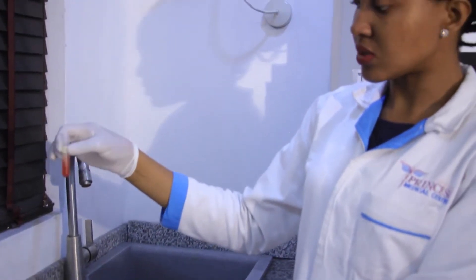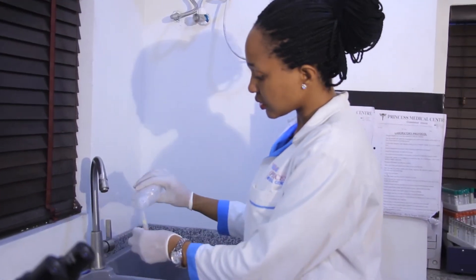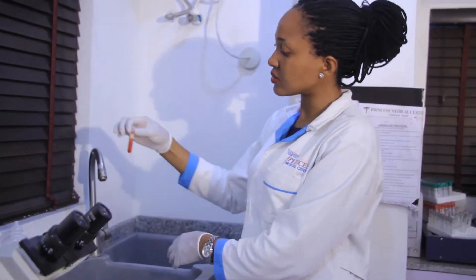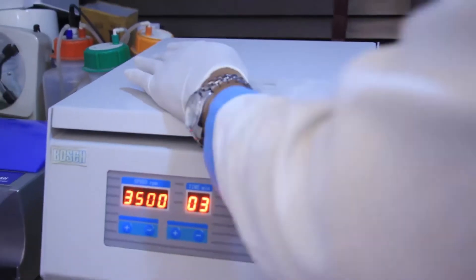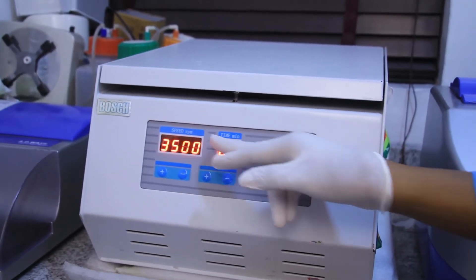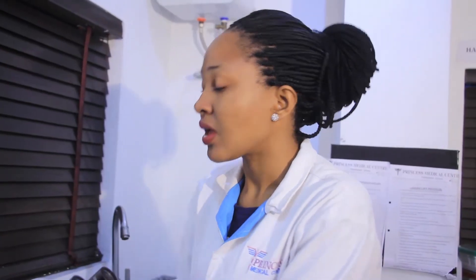Then we'll mix it. Afterwards, we'll top off with normal saline. We'll place this into the centrifuge and centrifuge it for 3 minutes at 3500 RPM. After 3 minutes, we'll dispense and top off again with normal saline. We'll continue this process for 3 times total.